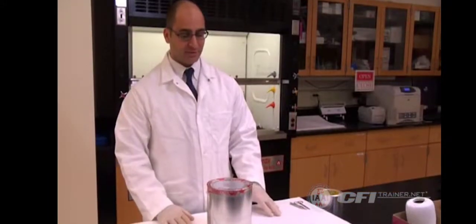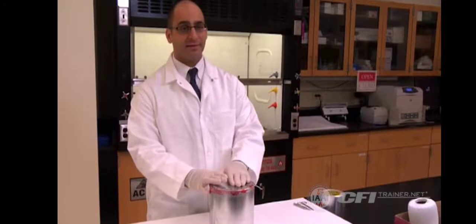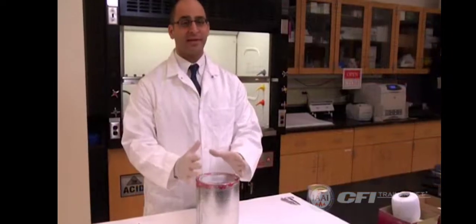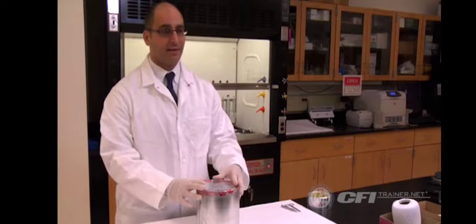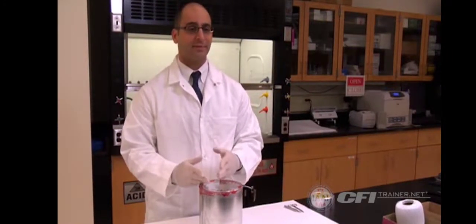And some other packaging issues are people not using proper containers. Once in a while, we will get things in paper bags. Paper bags are porous, so the volatile components that we're looking for will evaporate through the bag. It also presents a contamination issue. If different items are packaged in paper bags together, you will get migration of the ignitable liquid vapors from one bag to the other. Certain plastic bags are also unsuitable for packaging purposes, like your typical polyethylene garbage bag. It's not going to seal well, and polyethylene is somewhat porous as well, so vapors will escape.